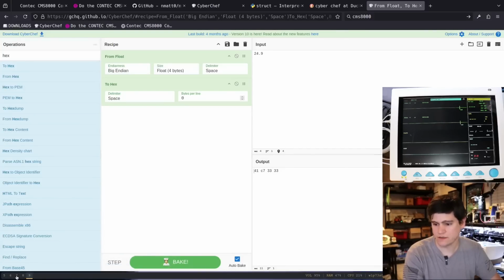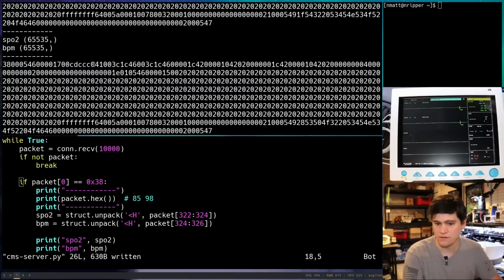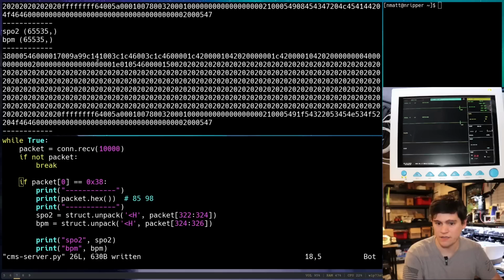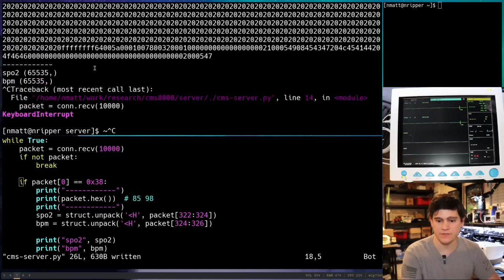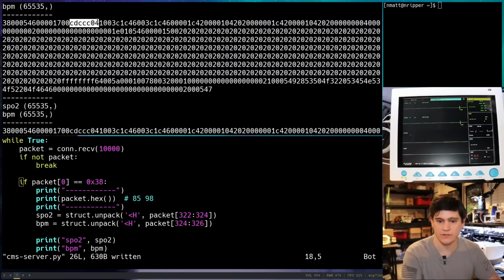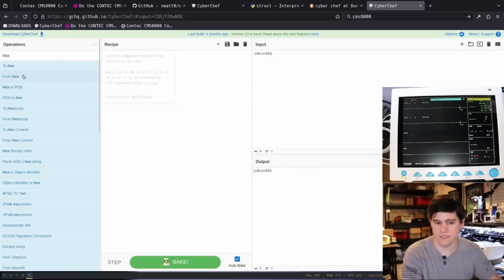Okay. There's that. 41, C1, 99A1. Okay, yeah. So I think this will actually serve us really well. Oops, wrong way. Okay, so this is potentially 41. Okay, let's put this in and let's do it backwards. I think this is it.